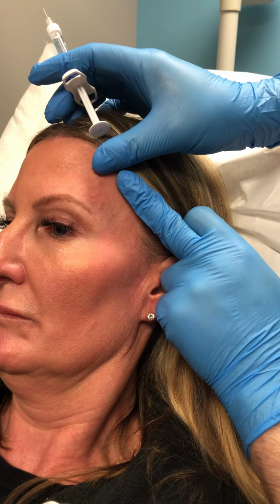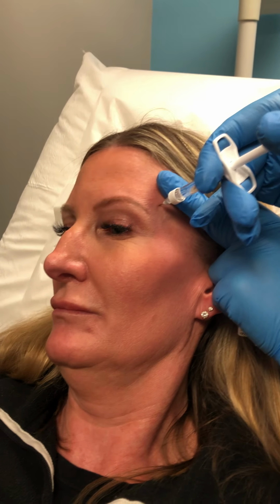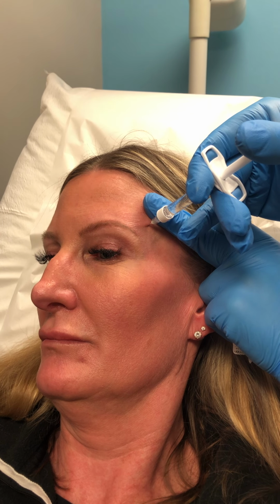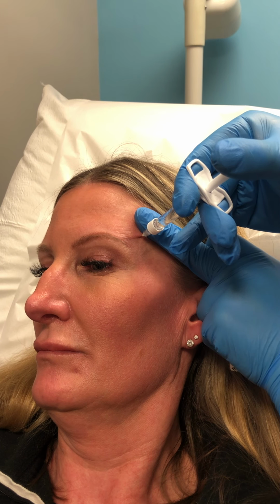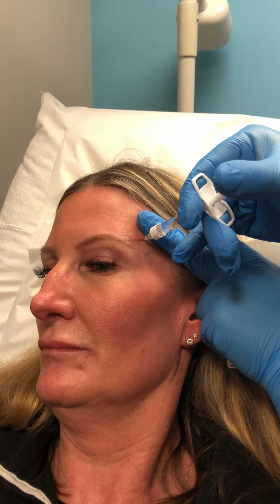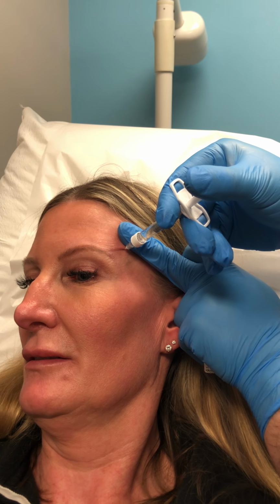And so, okay, that was it. And so we're gonna literally put in almost the entire filler here, nice and slow. And you should see this area volumizing here. We'll see it towards the end as it's all filled in. Can you feel or hear anything? Nope. Nothing? Not a thing. We're about to drop a whole thing in there.